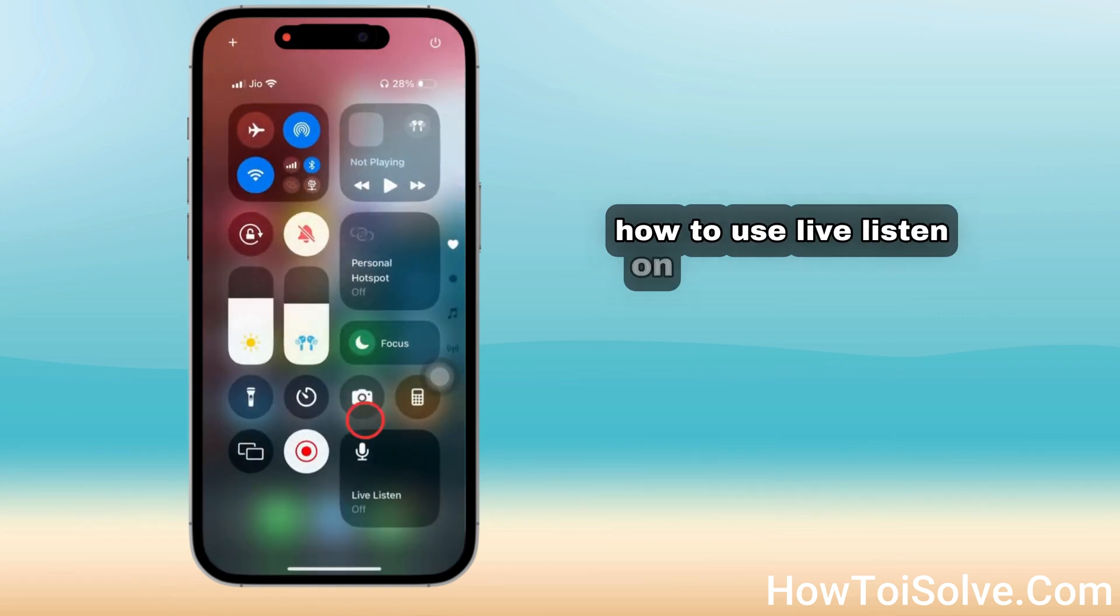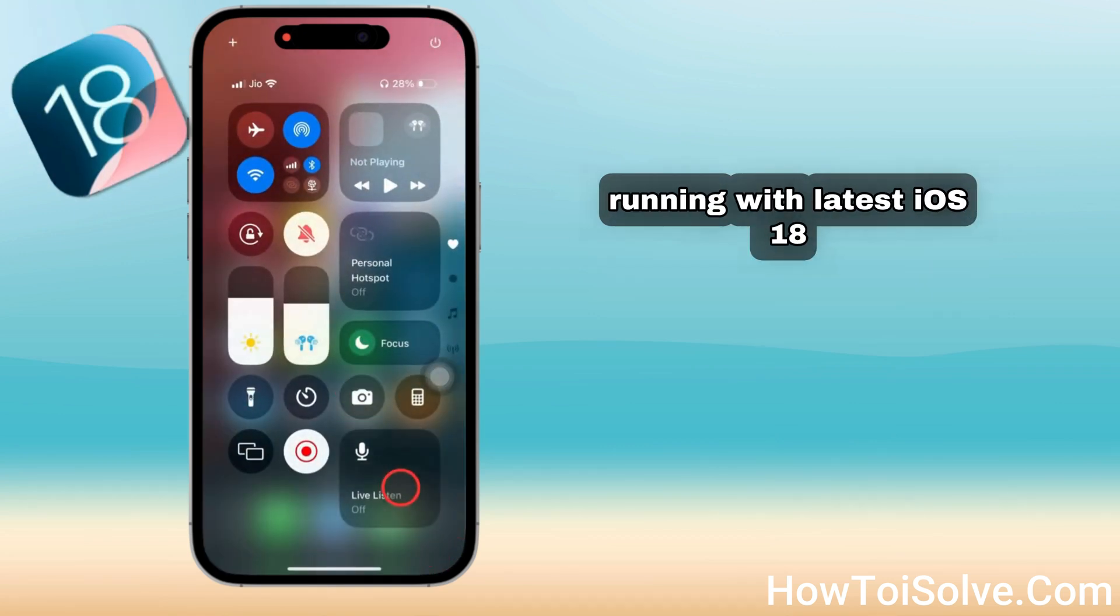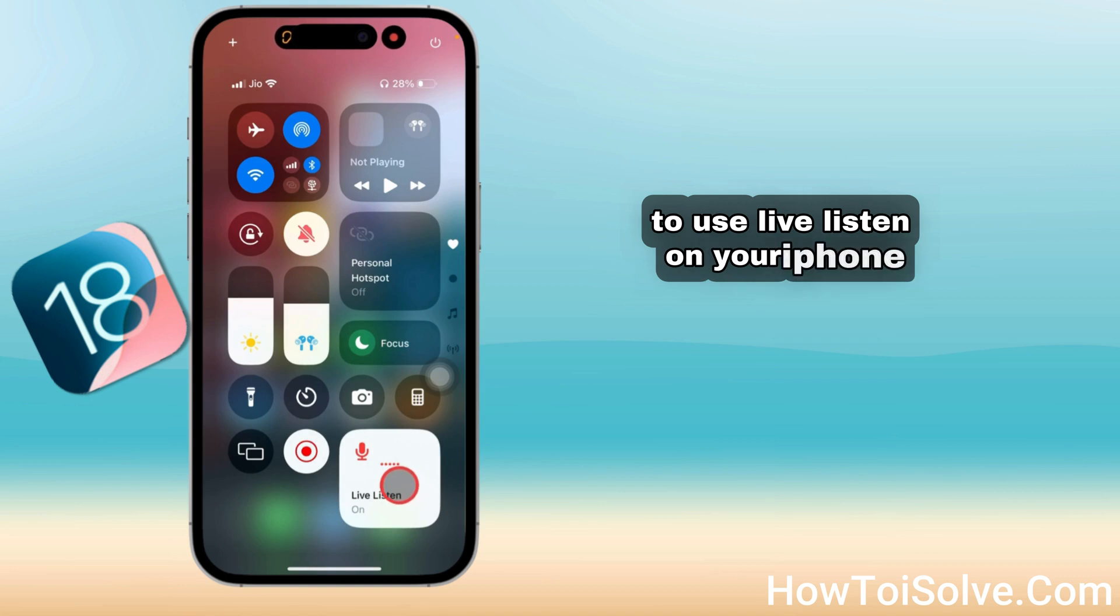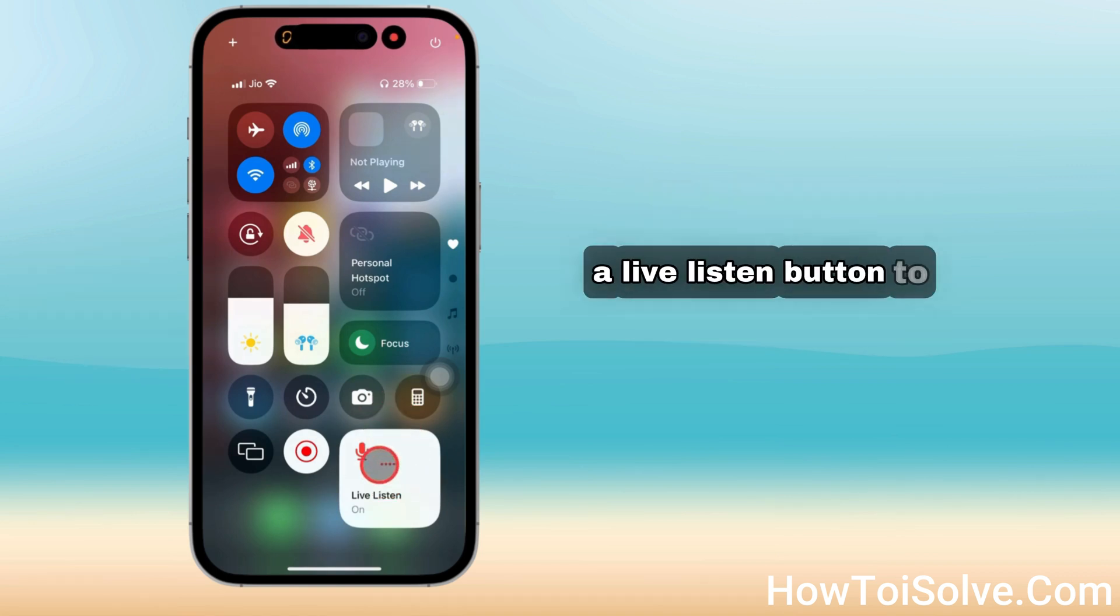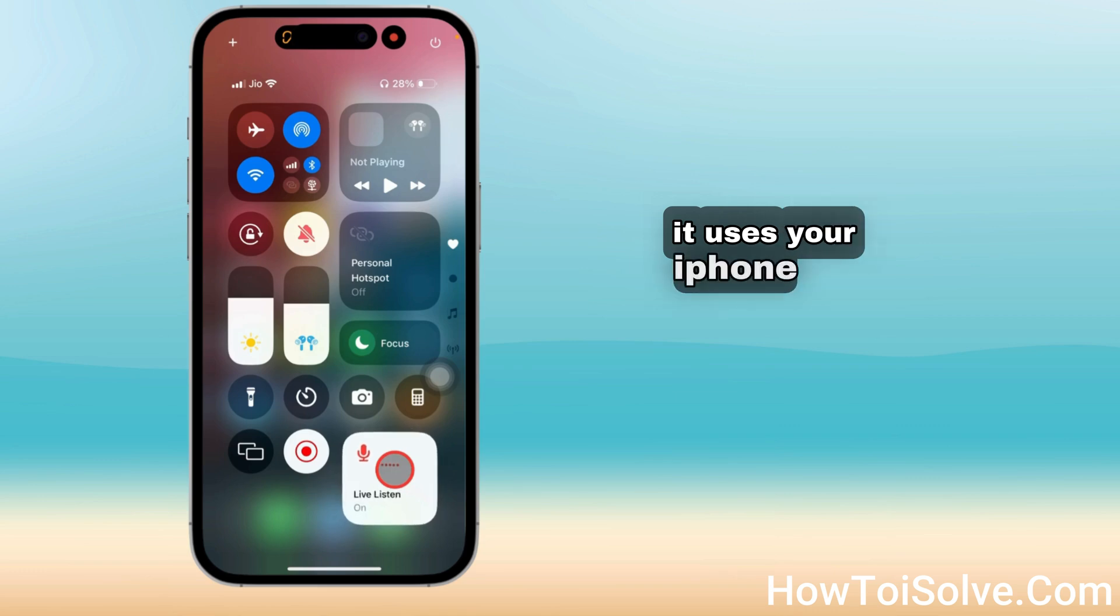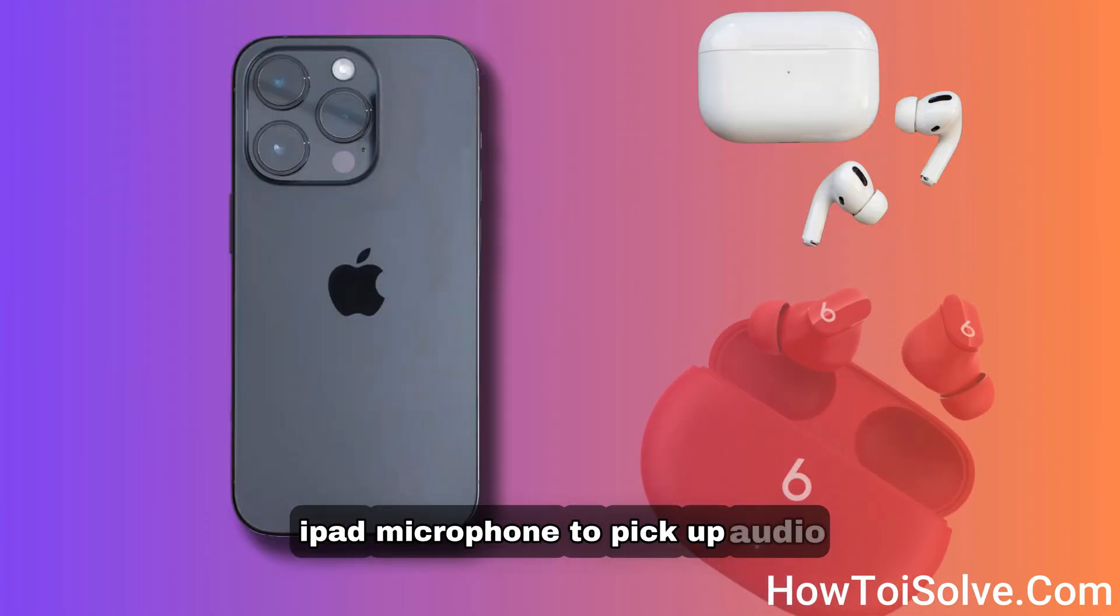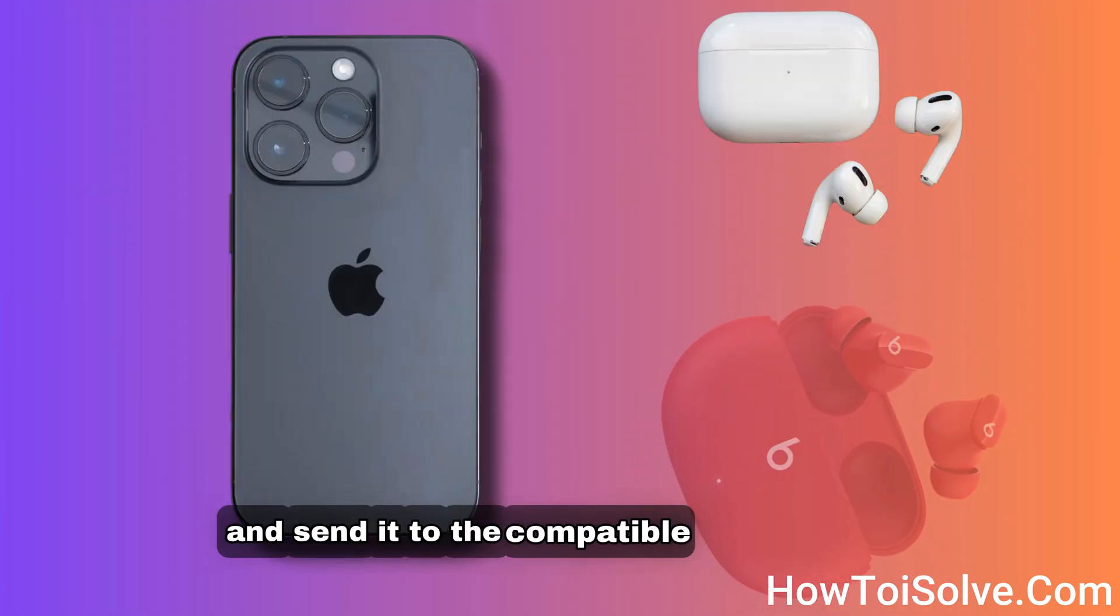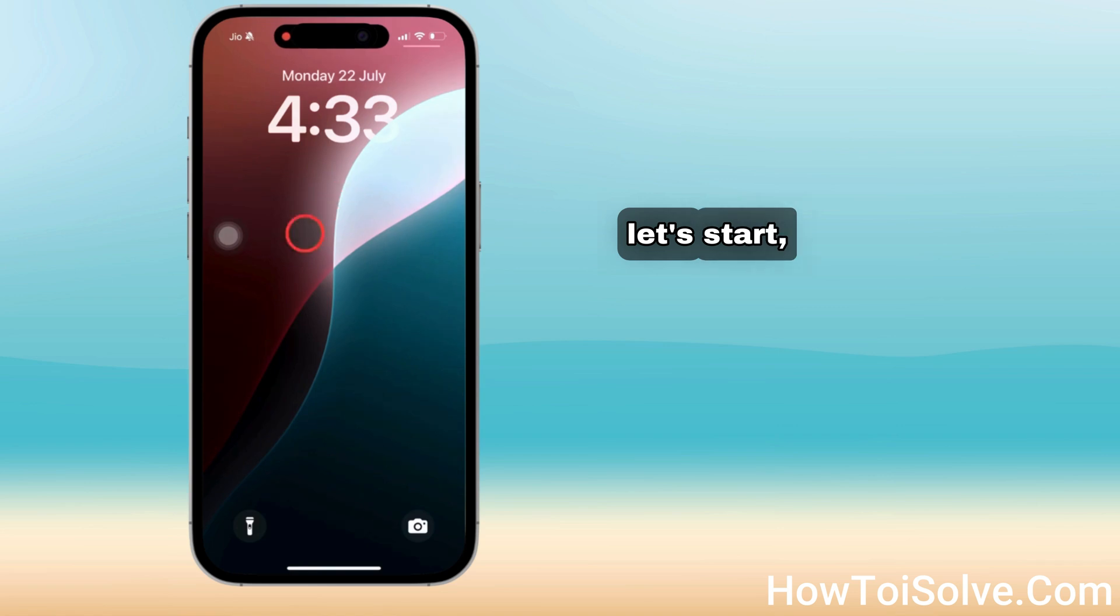How to use Live Listen on your iPhone and iPad running the latest iOS. To use Live Listen on your iPhone, you have to put a hearing button in the Control Center. Live Listen uses your iPhone and iPad microphone to pick up audio and send it to compatible AirPods. Let's start.